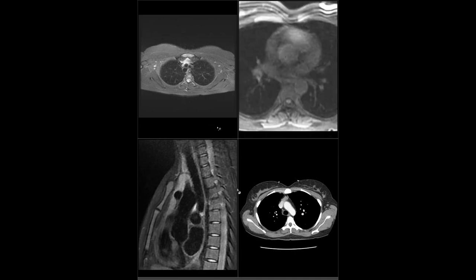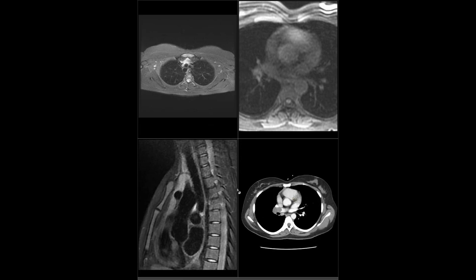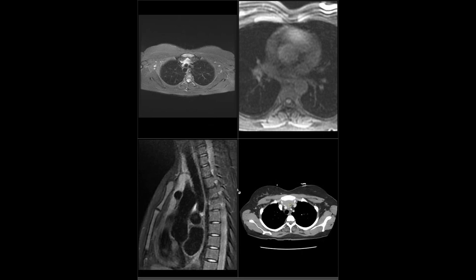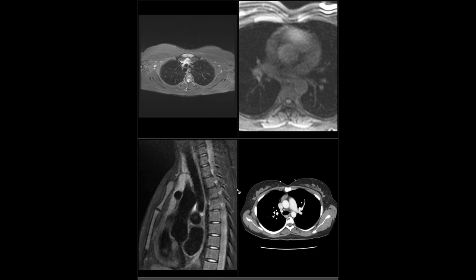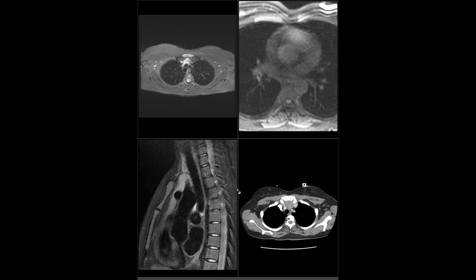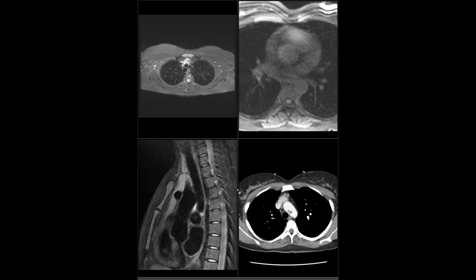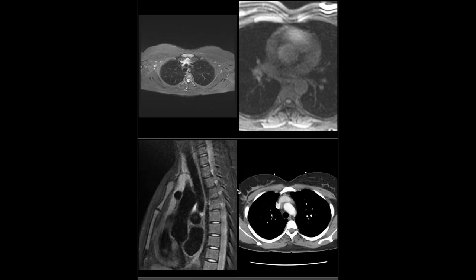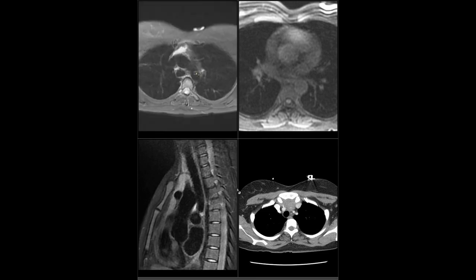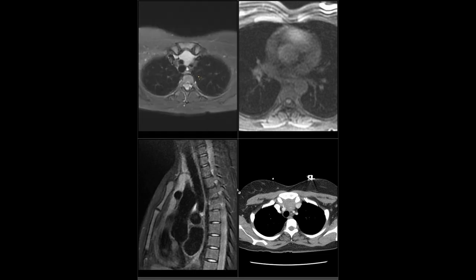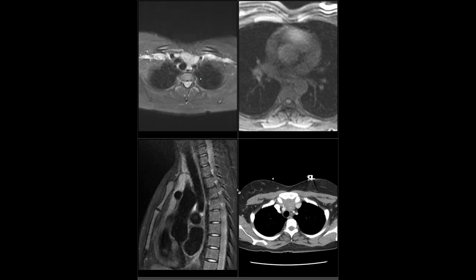What is against true thymic hyperplasia? Because there's an association between that and Graves' disease. There wasn't any signal dropout - but if you don't have enough fat, you may not get that signal dropout when looking for fat in thymic hyperplasia. That's a good thought - it's just ectopic thymic hyperplasia. Because it looks like a soft lesion - it drapes just like thymic tissue. There's a well-known association between Graves' and true thymic hyperplasia. I think that's the most likely explanation - certainly don't take it to surgery.